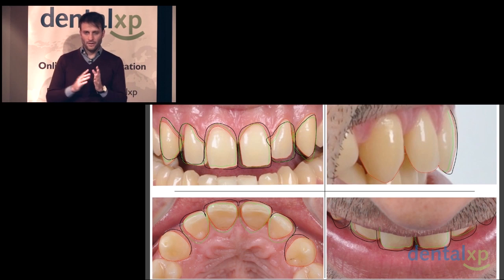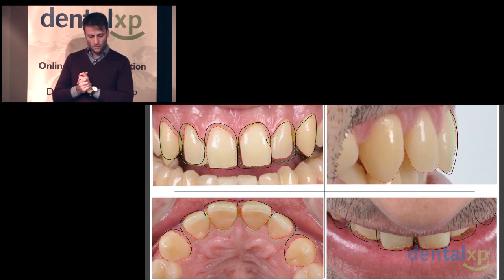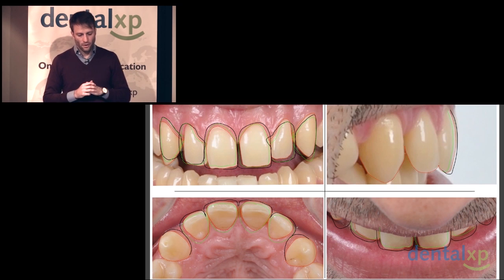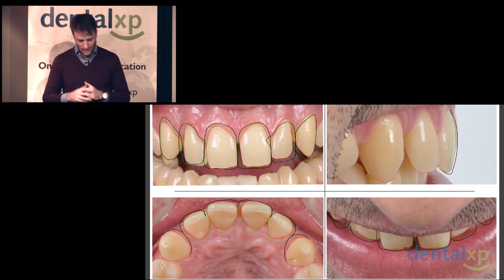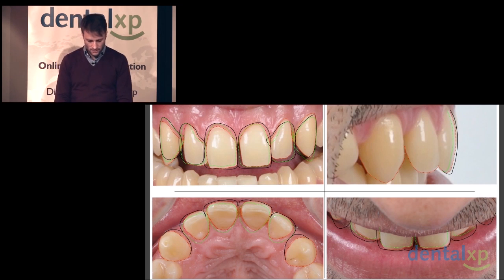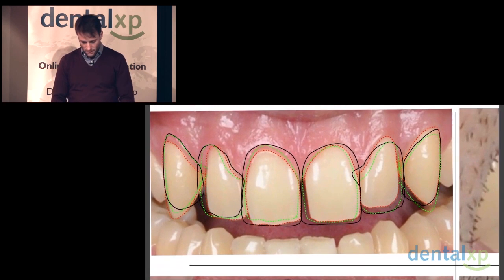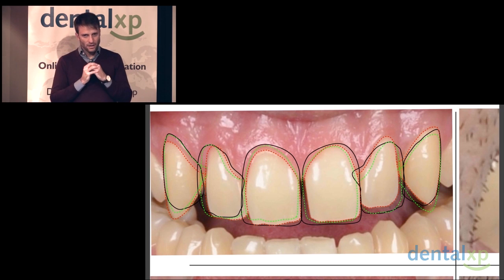On each view, I'm going to make some drawings to have a good idea about where I want the teeth to be. Following the facial guidelines, I'll first determine where I want the teeth to be — that's the black line. Then I'll draw in red where the teeth are right now, and this red line will be the key to calibrate the 3D image of the patient.